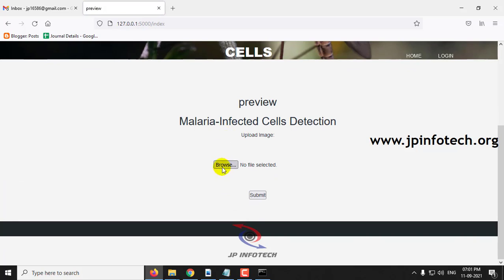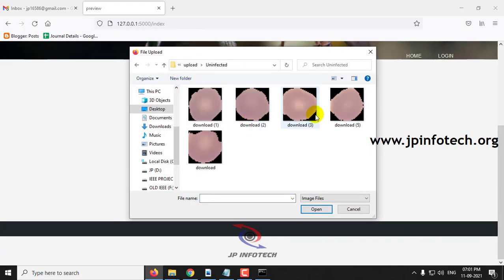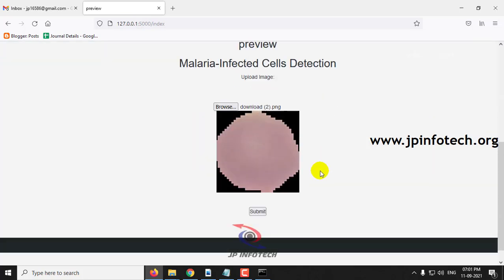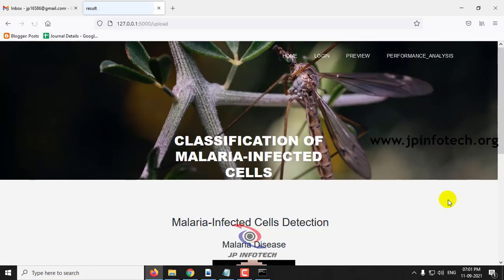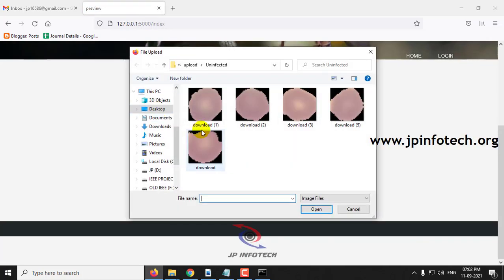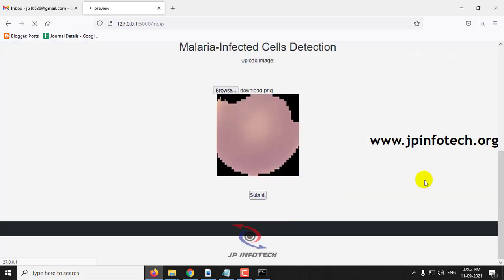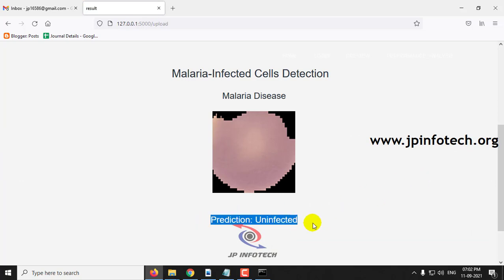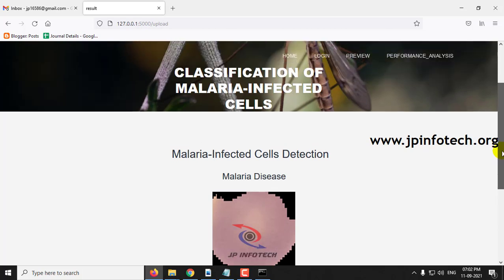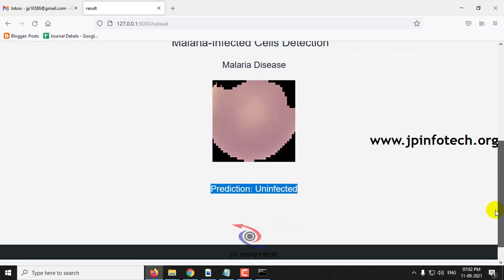Let me click the preview part again and go to the uninfected folder. Select an image, click submit, and here you can see the prediction is uninfected. For the test case I have shown you a few images on both cases — infected and uninfected. You can also check with other cases as well.